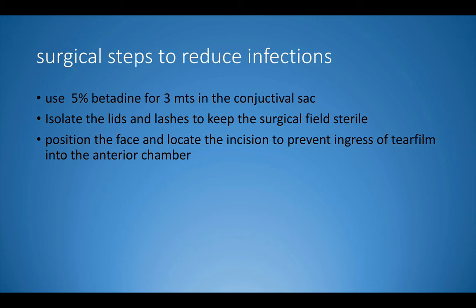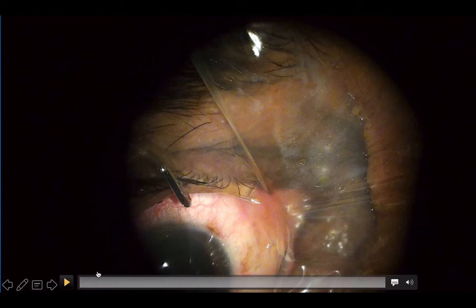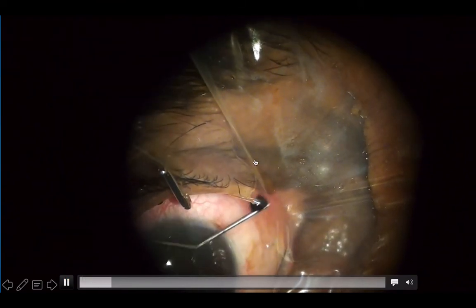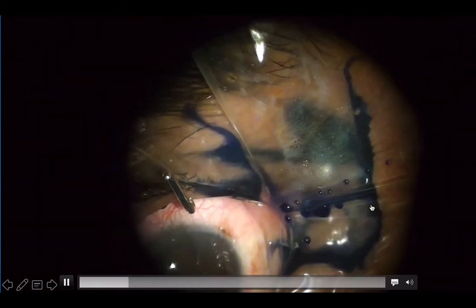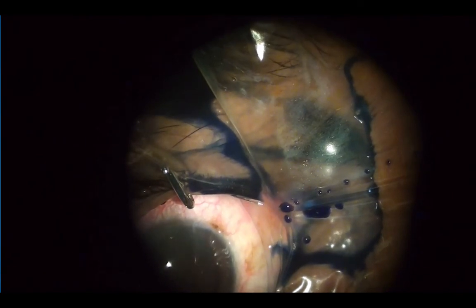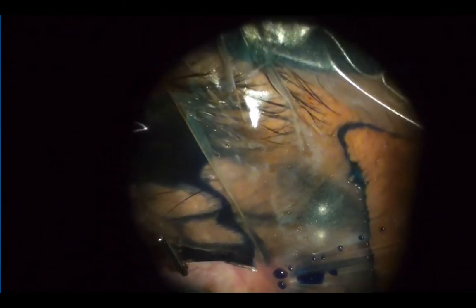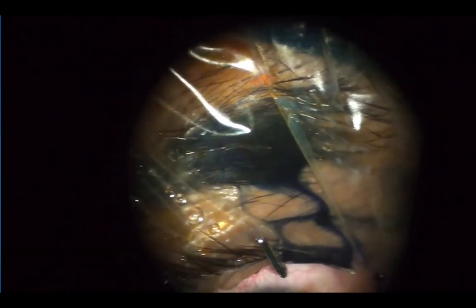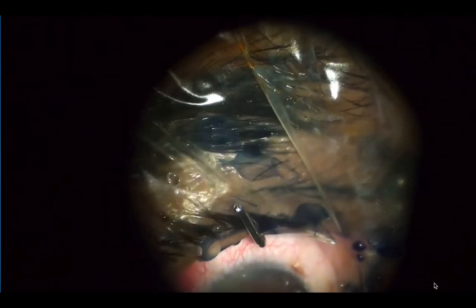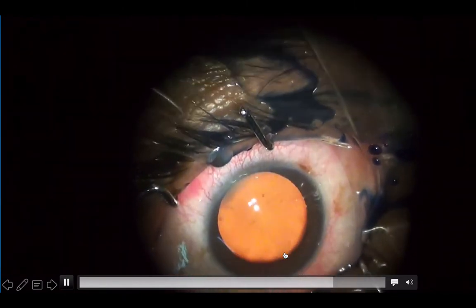Here is a patient just before starting surgery. I have moved the drape and am showing the medial end where the drape is not attached firmly to the skin. If I inject a small quantity of trypan blue in this location, we can see the extent to which this trypan blue has spread — it has spread quite extensively. So sometimes we feel that the patient has been draped well but that draping is totally inadequate, and the tear film is in contact with the surface of the skin over a very extensive area. The drapes are not foolproof.